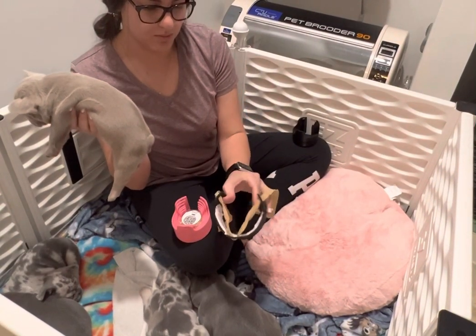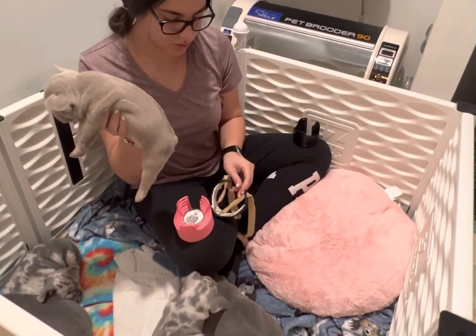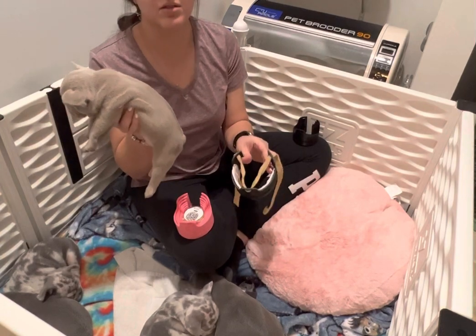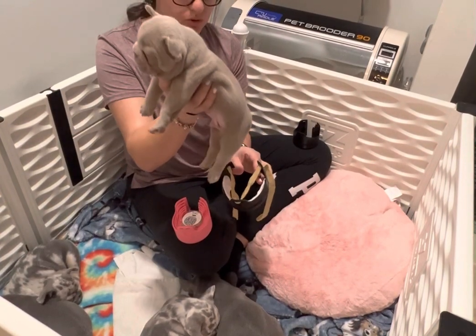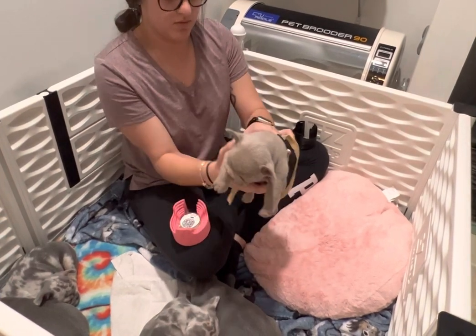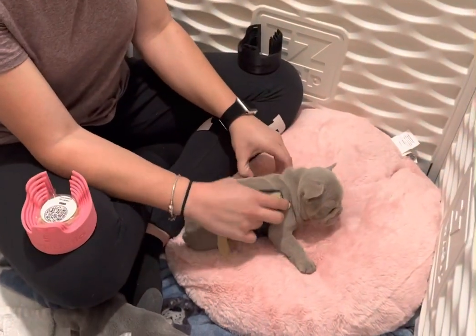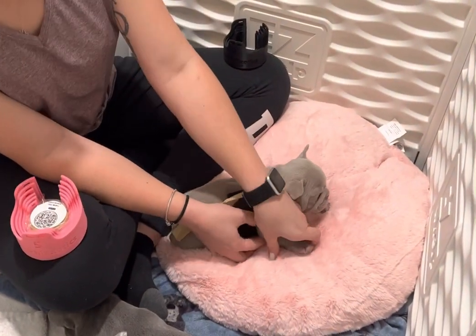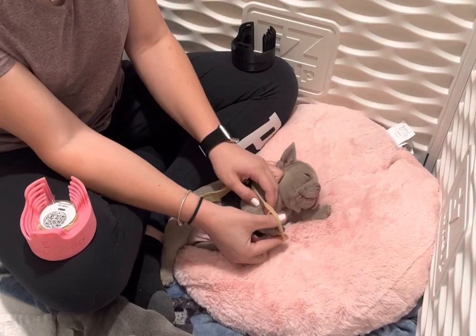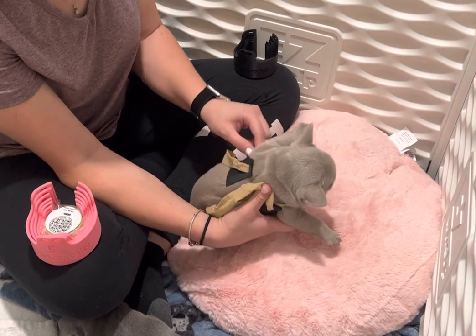You're going to want to stretch this out as needed. We've also improved the material components of the cast to make it more flexible. You'll want to insert the puppy feet first and you'll want this side to be on the back. These loops will be for the arms. You can tighten it, same for the other side.